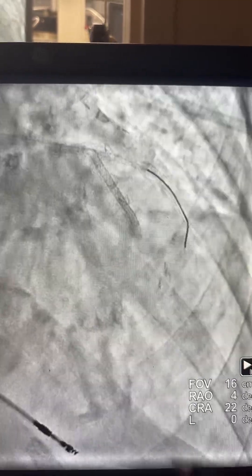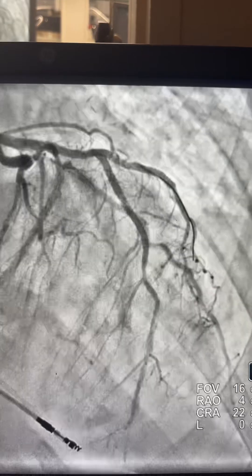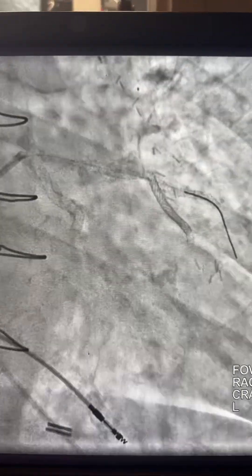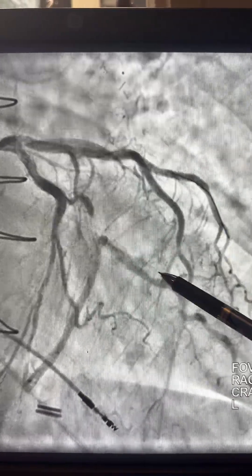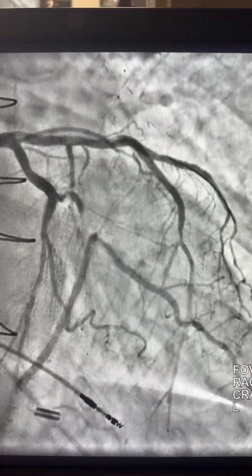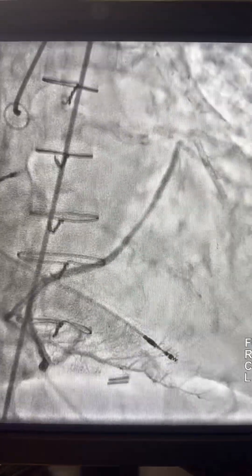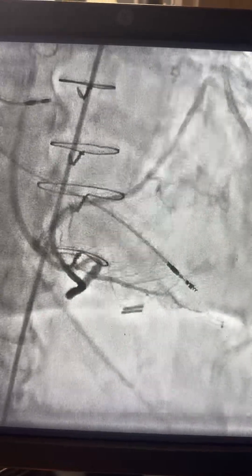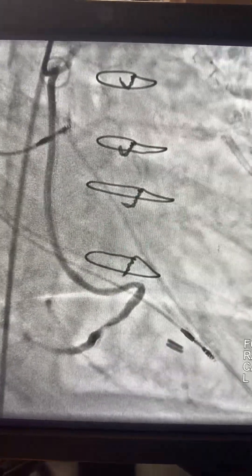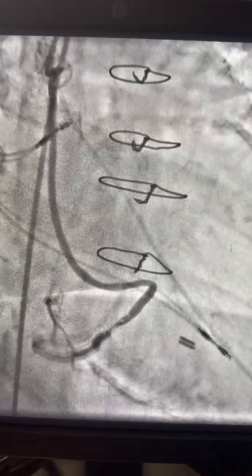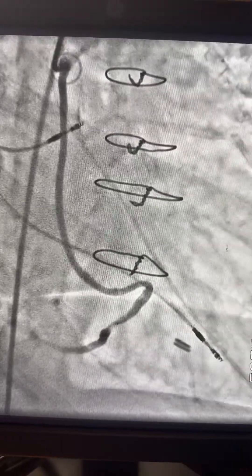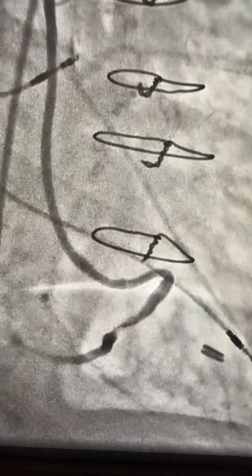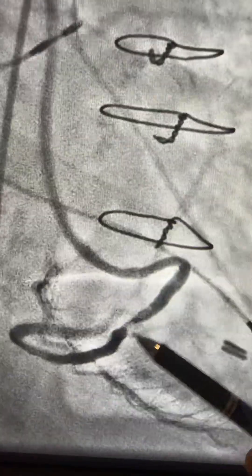We still have some flow here from the atretic or small LIMA. Here is a different view where you see the circumflex and the graft toward the OM. Going back to the SVG graft itself, which is a long graft feeding the OM and the RCA — it's feeding the RCA PDA and also giving flow to the OM. However, see this lesion here — a very tight thrombotic area.